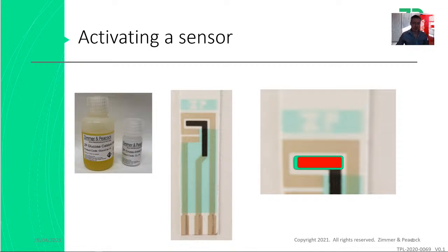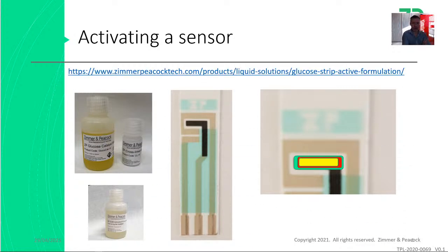Something that we touched upon last week was you can also add a barrier layer. That barrier layer is going to be important to part of this discussion. So at ZP, you can make a glucose sensor on one of our electrodes using essentially a 3-step process: enzyme layer, cross-linking layer, and then when they are cured, an actual barrier layer. We only really first mentioned the barrier layer last week.